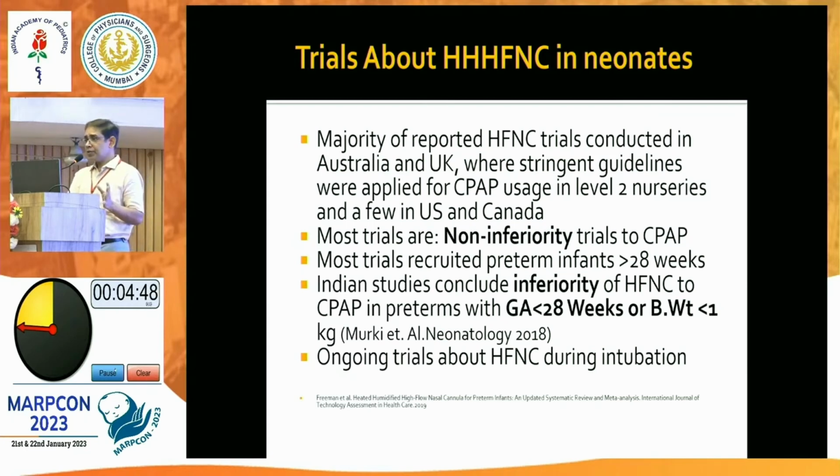And most of these trials have been conducted overseas, but there are Indian studies also. All these trials are non-inferiority trials. Non-inferiority means the study has already assumed that CPAP is the gold standard. So they are just trying to prove that high flow cannula is just as good as CPAP, not better than that.